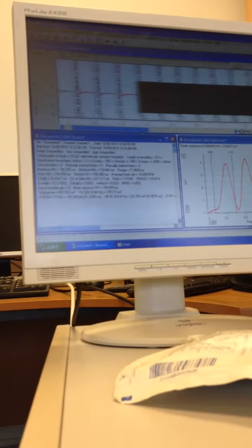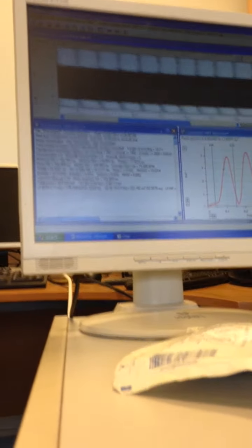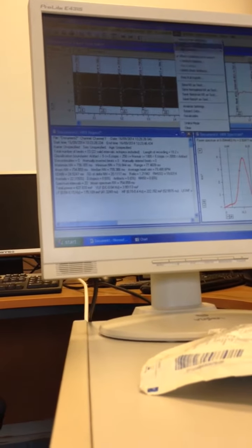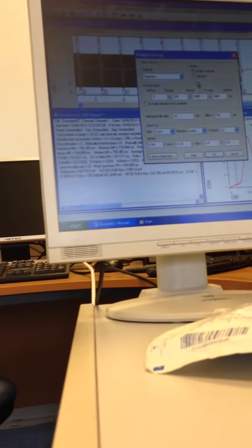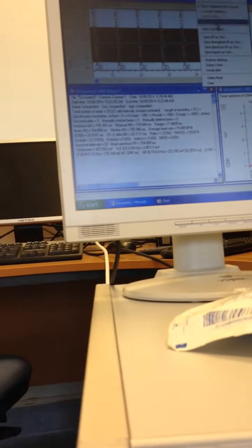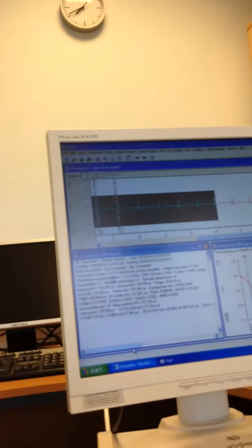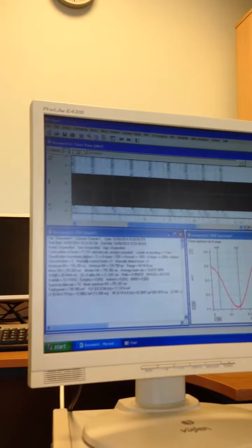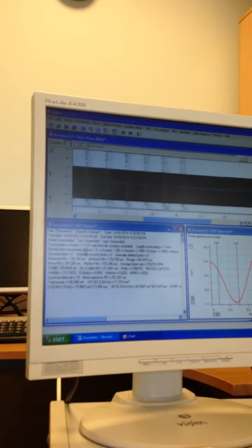So just from 1 to there. Well, no, it's calculated. Oh, hold up, because I've had it on whole channel. Selection, okay? Glad you're getting all this in video. Yeah. And then it says recalculate. So it's calculated just that period of time. Brilliant. Only from 4 to 15.